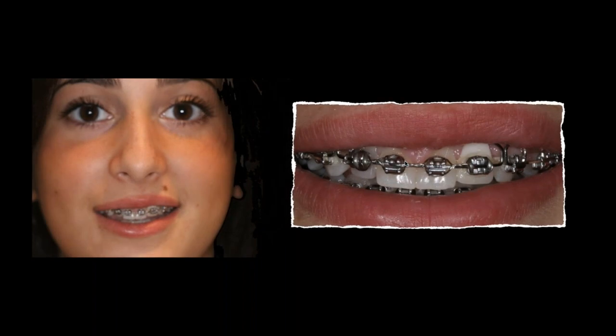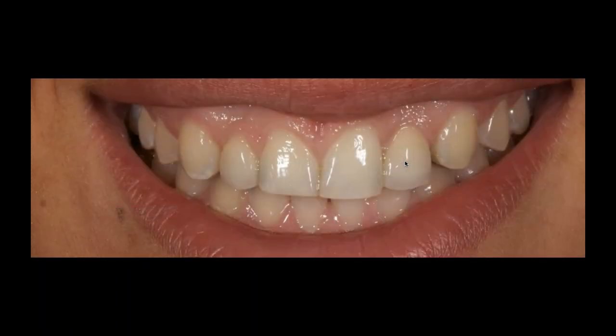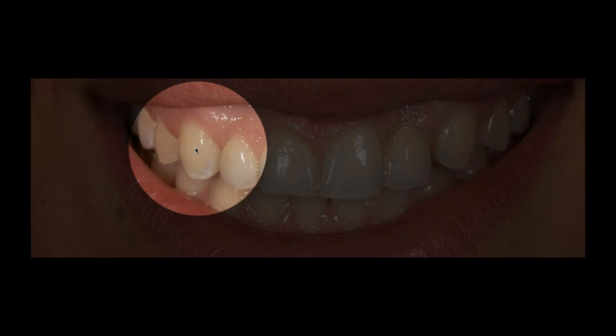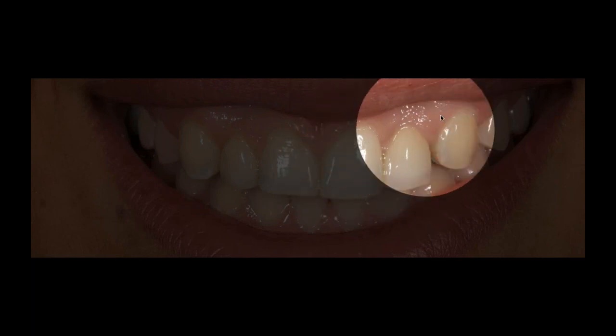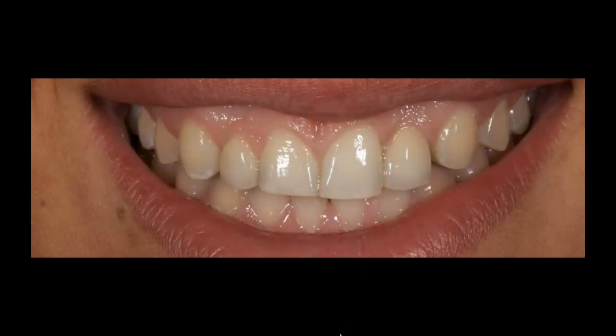But we wound up putting her in some ortho, moving the teeth around a little bit, and creating a little bit more ideal space for the patient. At this point, when she was about 16 or 17, we actually fabricated a Maryland bridge. And old school-wise, it's kind of funny because this is actually a 6-unit Maryland bridge. I have a metalingual on the cuspid, a pontic, metalingual, pontic, and another metalingual. So it's actually a 6-unit metal Maryland bridge. And today I would never do that. Today, every Maryland bridge that I make has one wing on it.